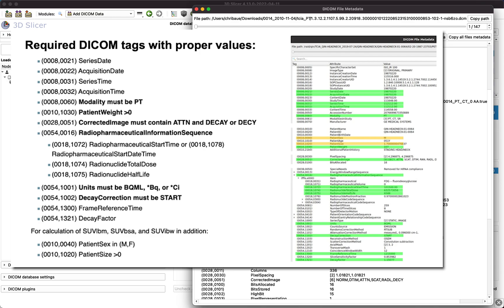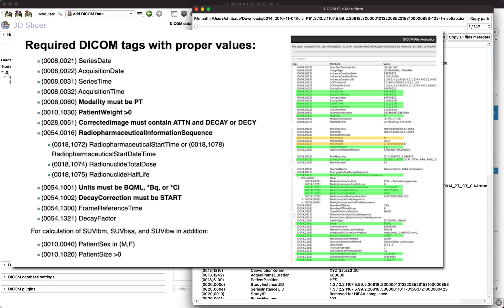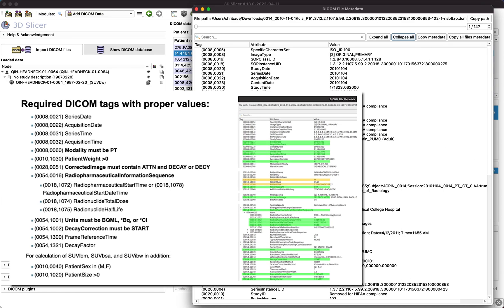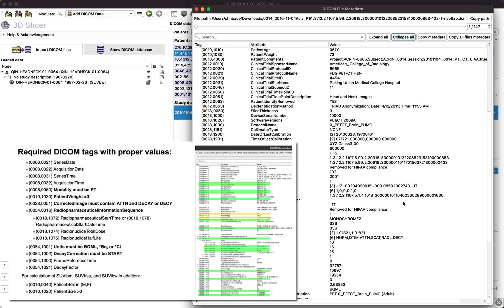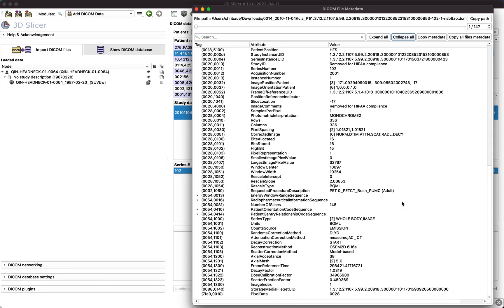If any of those fields in the DICOM data are missing or not valid, SUV calculation will not be possible. Sometimes fields are removed or replaced accidentally during export from a PACS or data anonymization, and one must fix the DICOM data to overcome the problem.